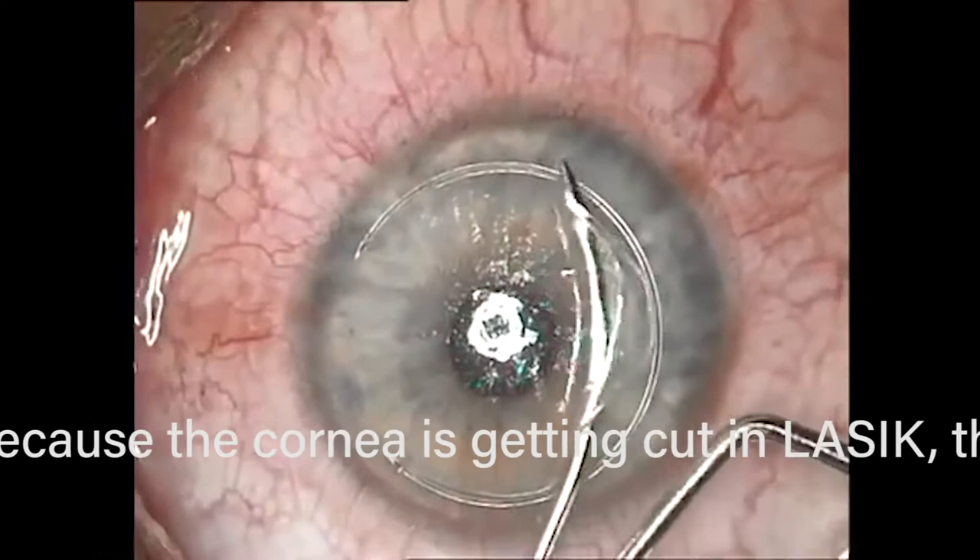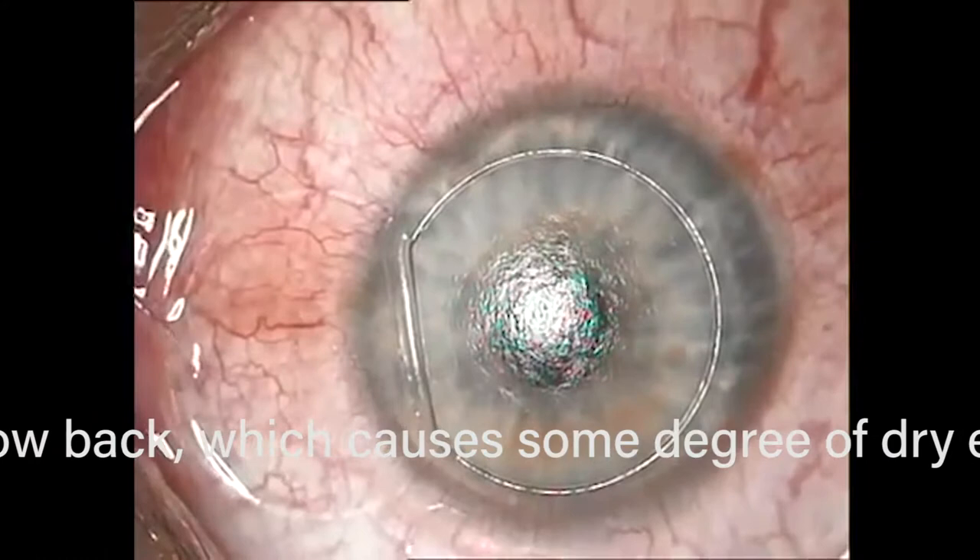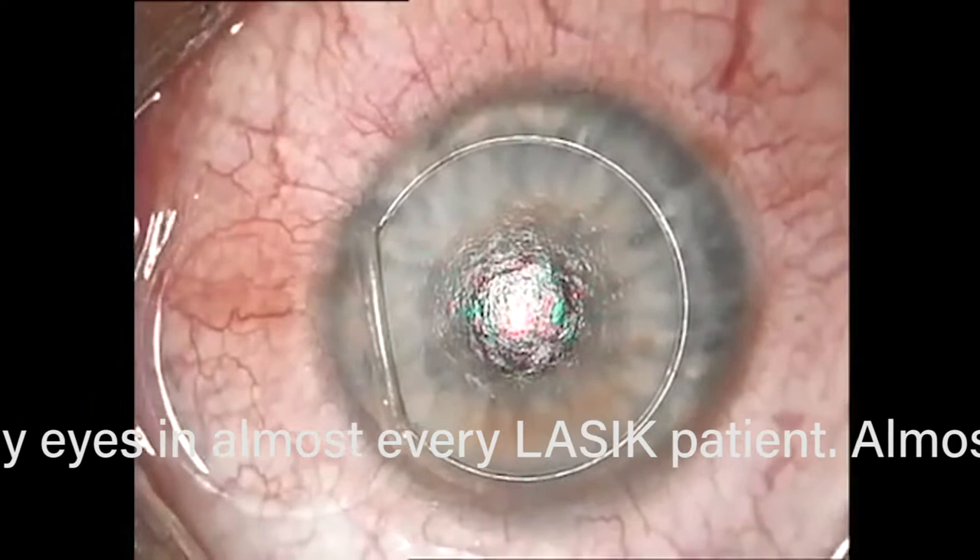You can see the edges are perfect, and because the epithelium — the skin of the eye — comes up with the flap on top rather than being removed, the recovery is quick. There's going to be a one to two day recovery. That's why people say, 'I had LASIK done and came back to work the next day' — because all you have to heal is the edge of the flap. The epithelium doesn't have to grow back.